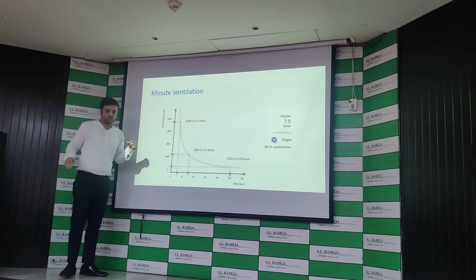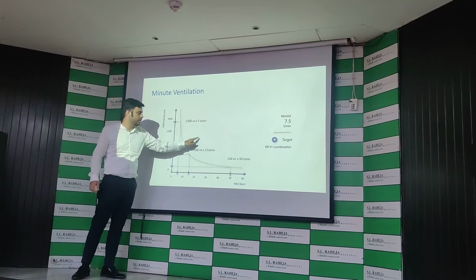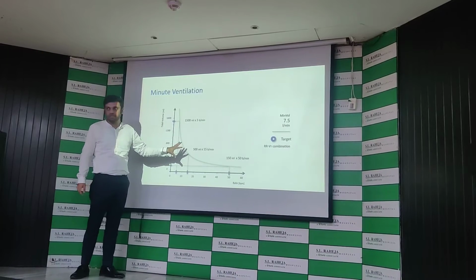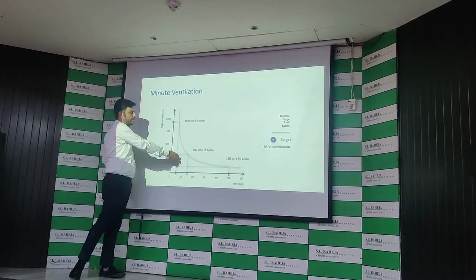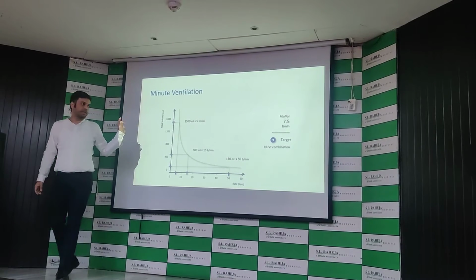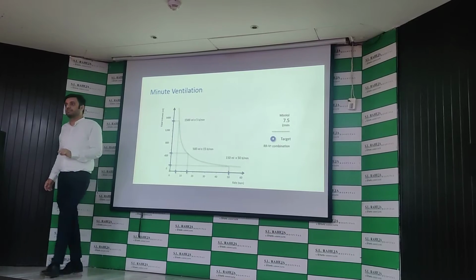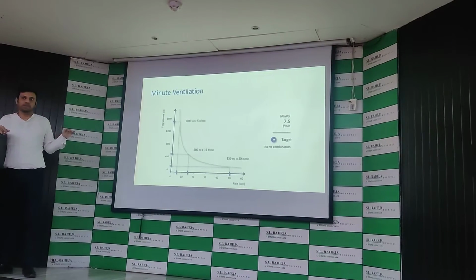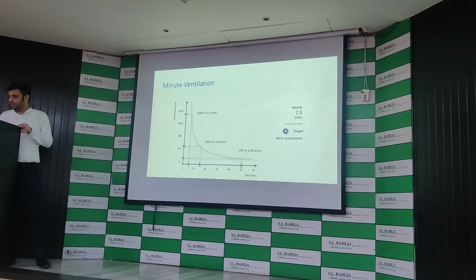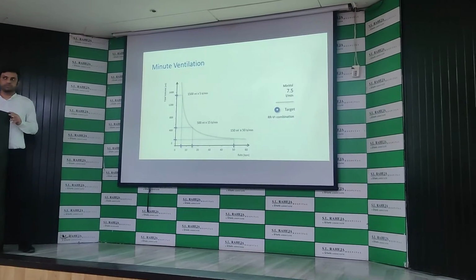Usually, what Ramesh also explained is regarding the safety square. If the safety square lies in the middle in the square form, that means we are in the safer zone. If it is a rectangular vertical form, then it is for the obstructive. If it is a rectangular horizontal form, then it represents the restrictive part. So automatically the volumes will be delivered less with a high respiratory rate. It calculates the safety zone by actually looking at the tidal volumes and the pressure.